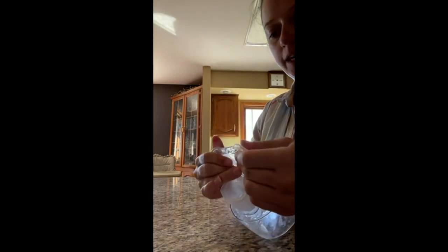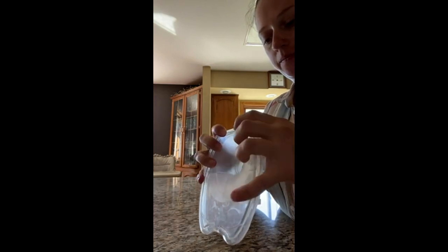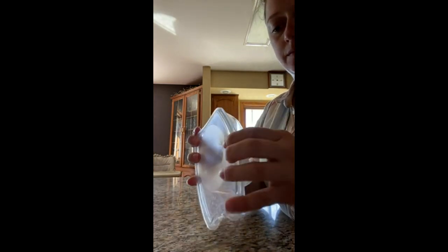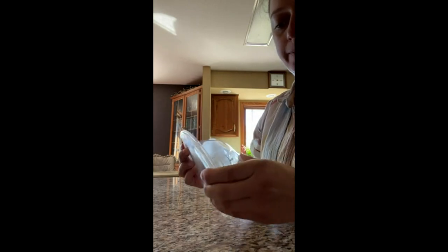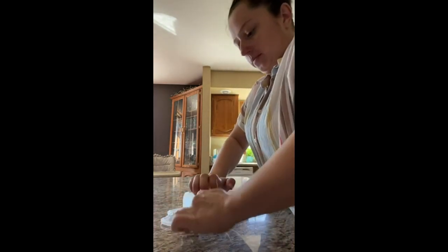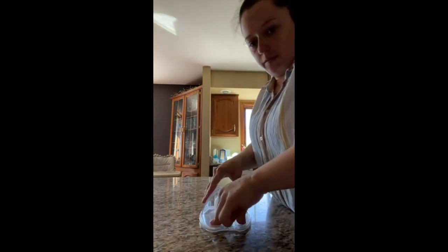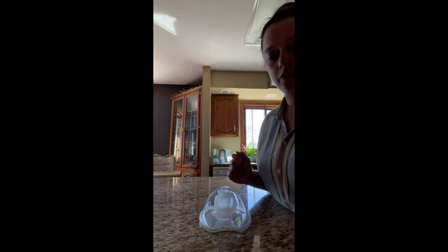So you just kind of slide it on like this, and then once you have it kind of pressed on, I found it helpful to double check by pressing it flat on a table. I do that to ensure it doesn't leak.